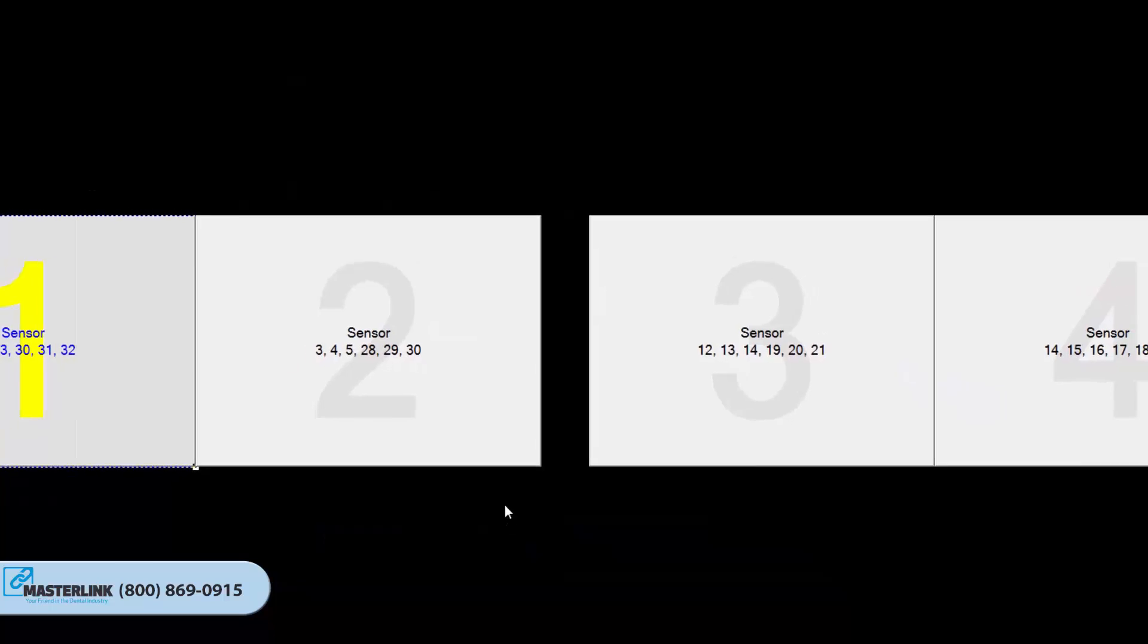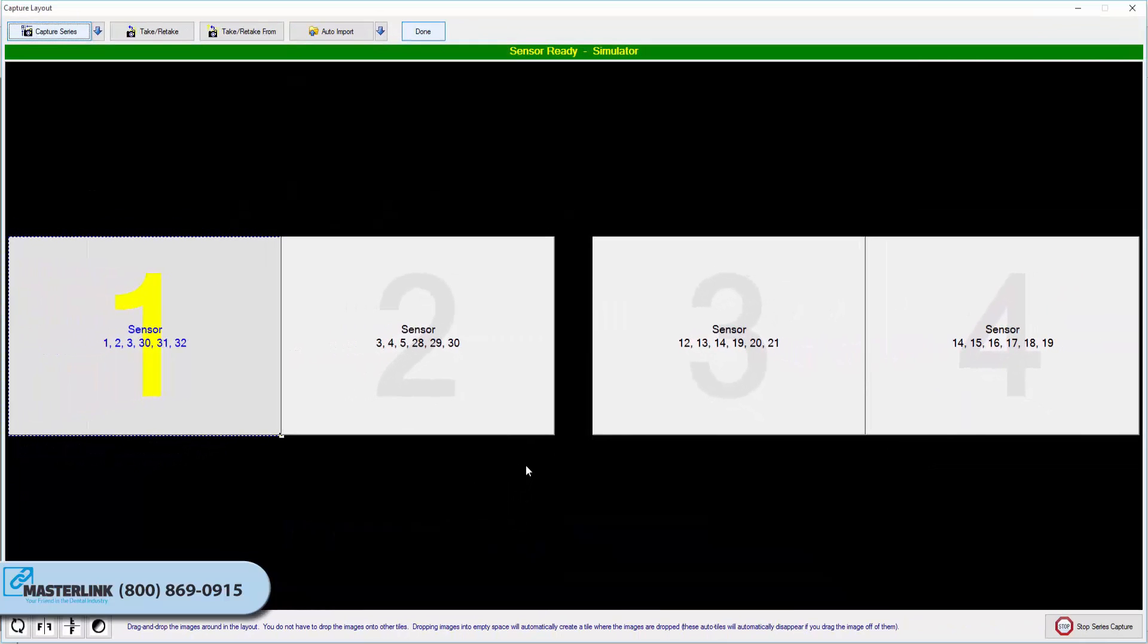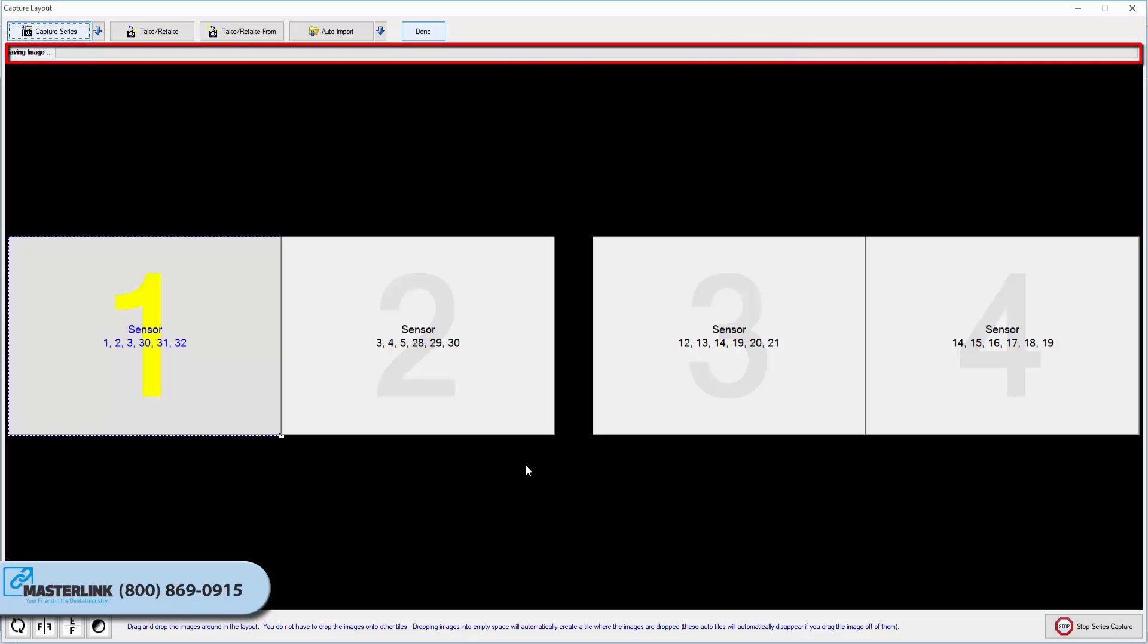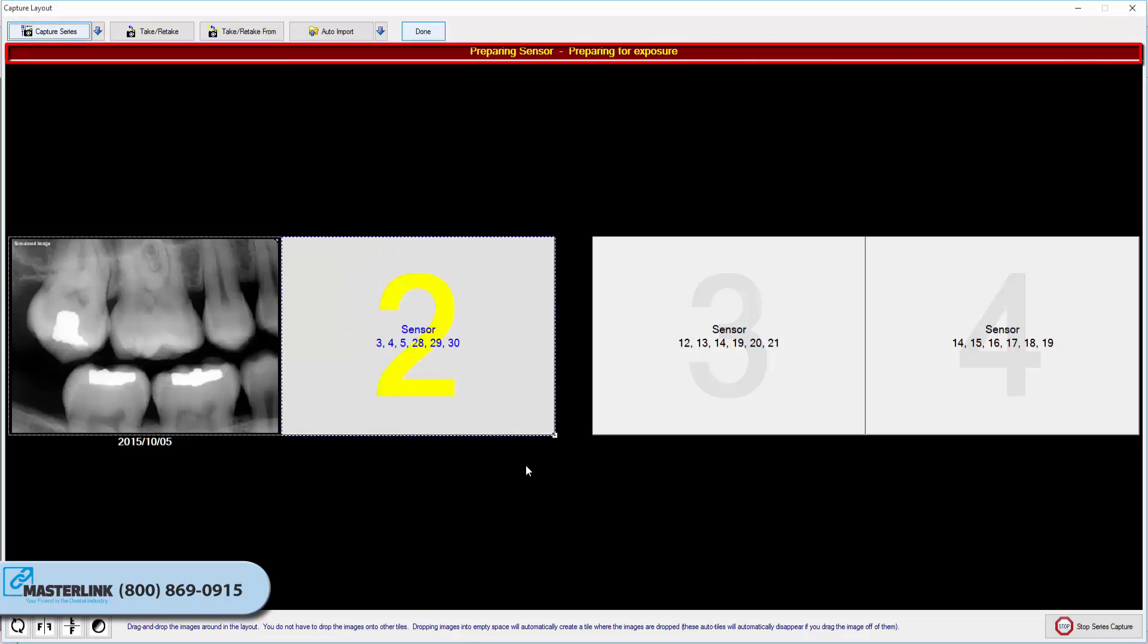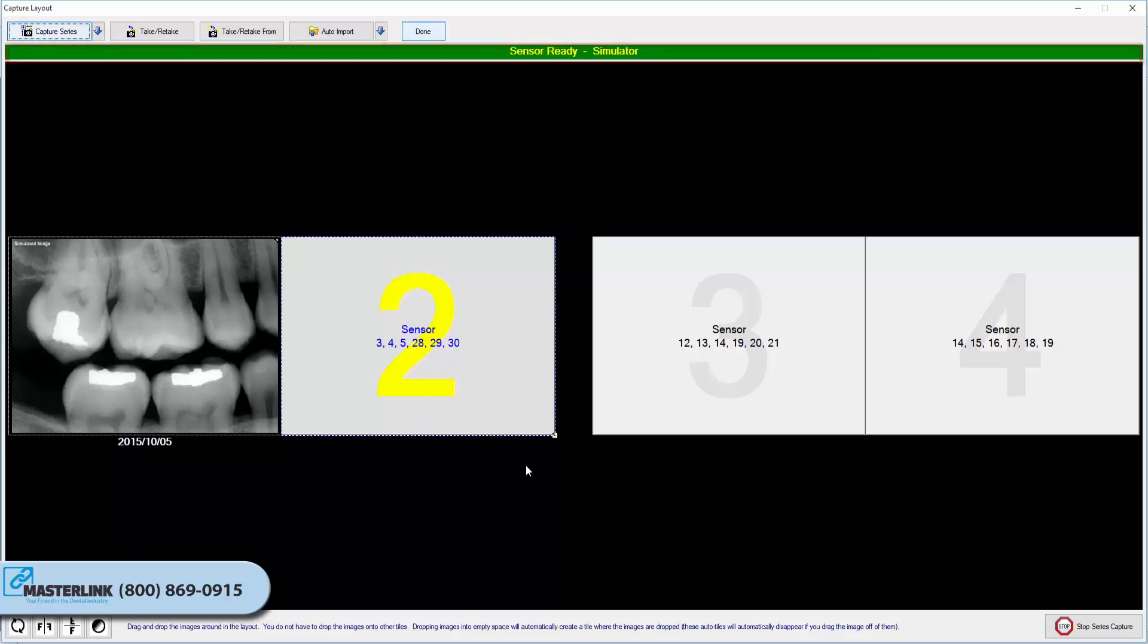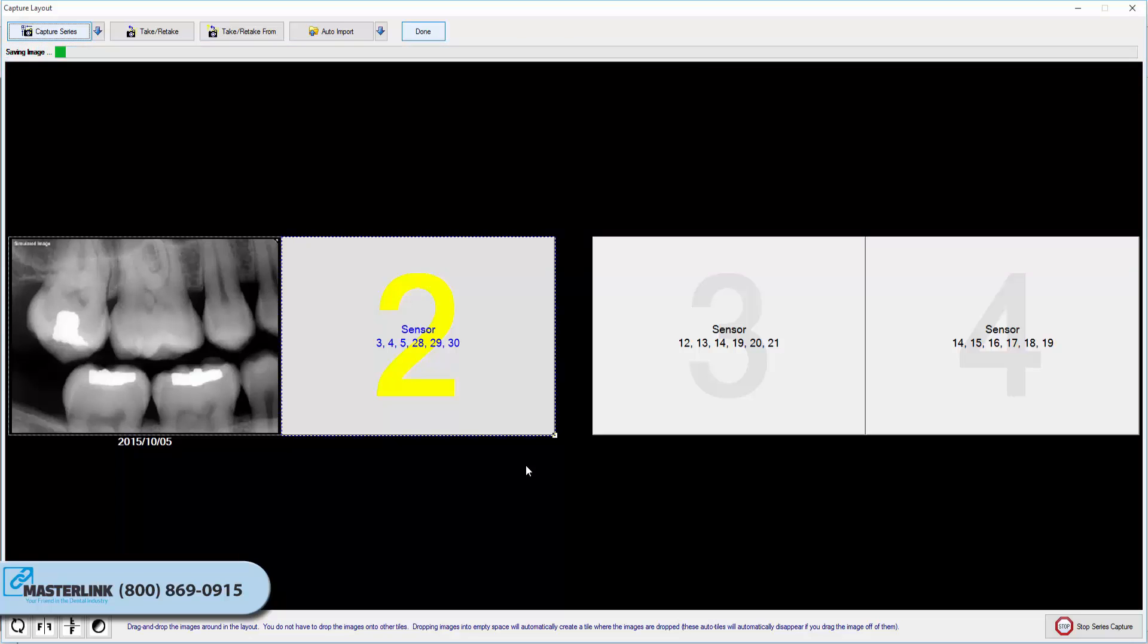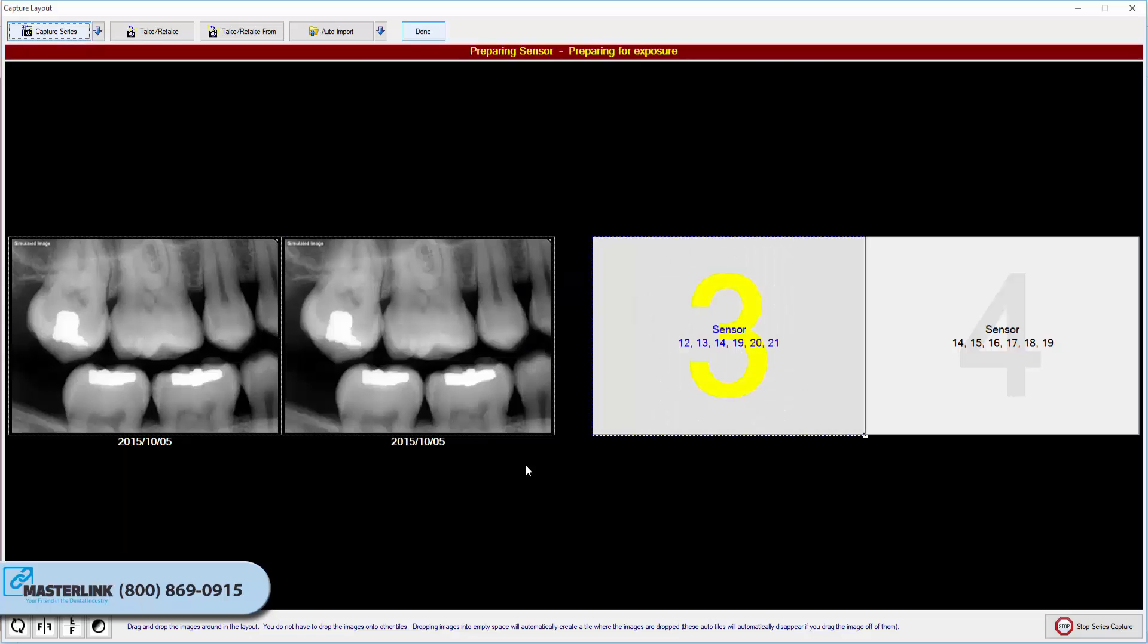The software will advance and prepare the hardware for X-ray exposure. The indicator will turn green when the sensor is ready to capture an image. A vocal cue will also be heard if the computer has a sound card and speakers. Proceed to shoot the X-ray. The new image from the hardware will appear in the selected tile.